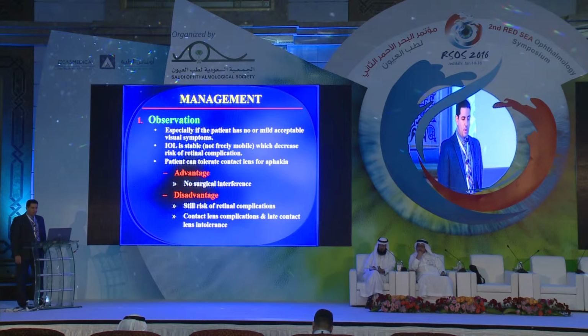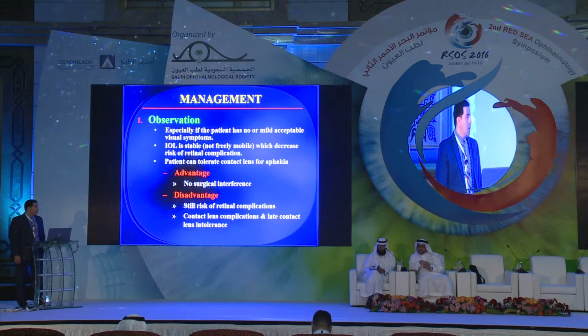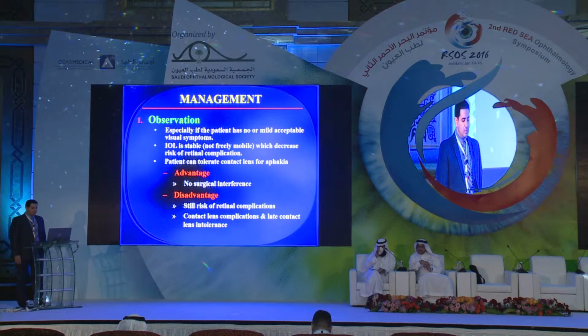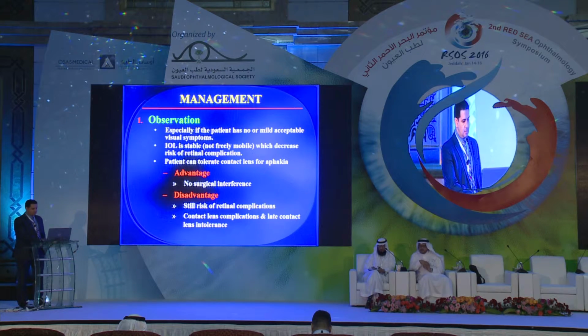What is our management for IOL dislocation? There are old ways of management, which I think nobody is following nowadays, but we will enumerate them. Number one, observation, especially if the patient has no or mild acceptable visual symptoms, if the IOL is stable and not freely mobile so the risk of retinal complications is very low, and the patient can tolerate a contact lens for aphakia. The only advantage is no surgical interference, but there are disadvantages: still a risk of retinal complications, contact lens complications, and late contact lens intolerance.